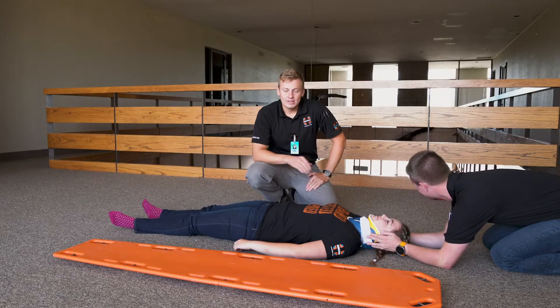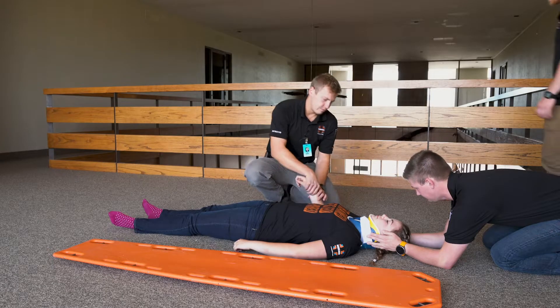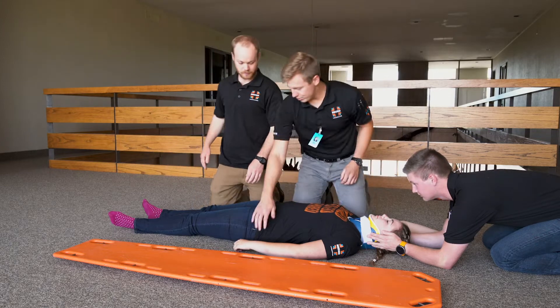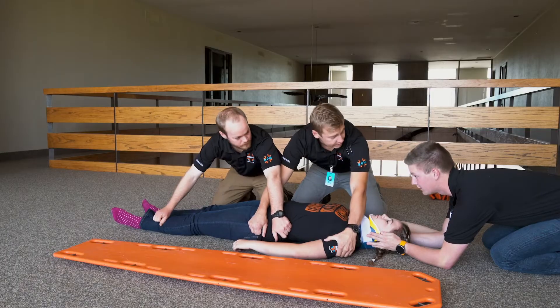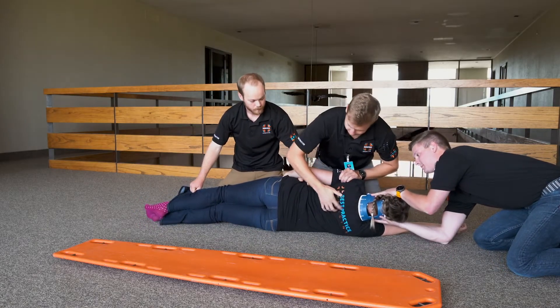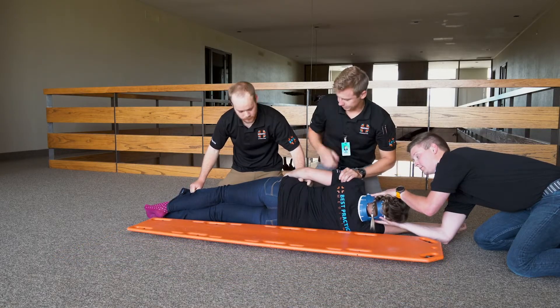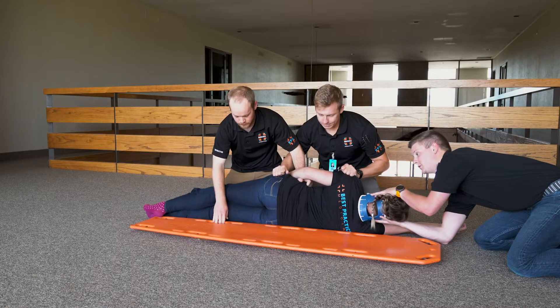Position the immobilization device next to your patient, and then direct the movement of the patient onto the long spine board. We're going to roll you — put your arm all the way up above your head. I got shoulder and hip. Grab upper hip. One leg. Head scout — is anybody not ready? One, two, three.